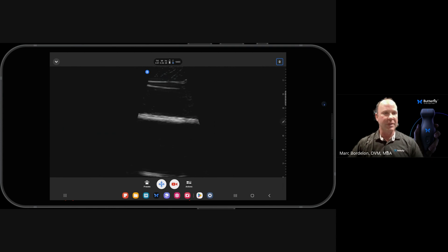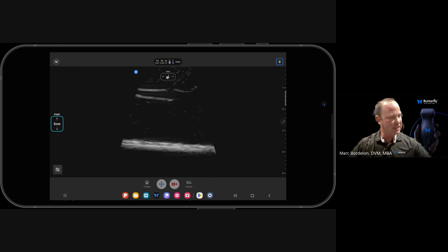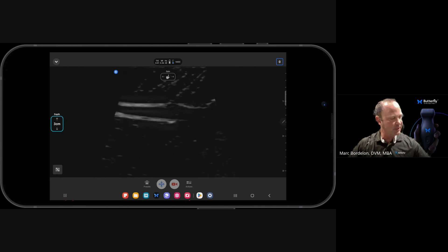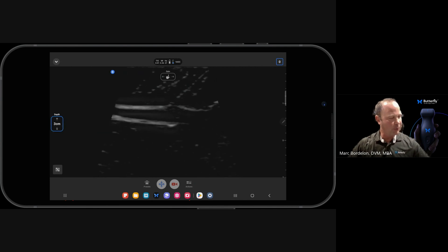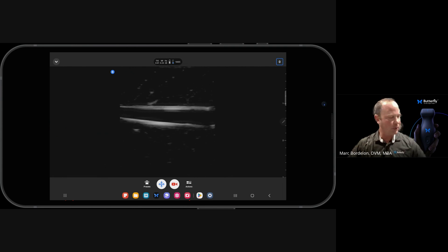Let's make sure we're in the right preset. Let's make sure we're at the right depth so I can see that I'm way too far out. So I'm going to decrease my depth to more appropriate depth where I have my structure of interest in the center of the screen.